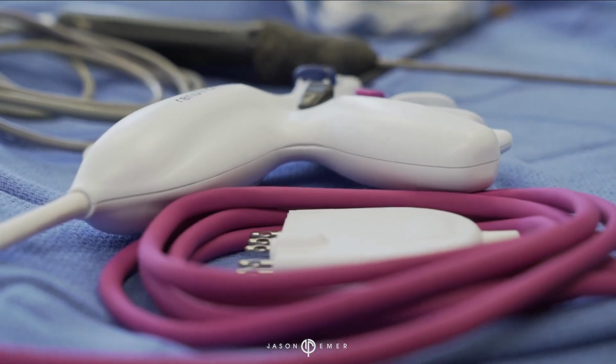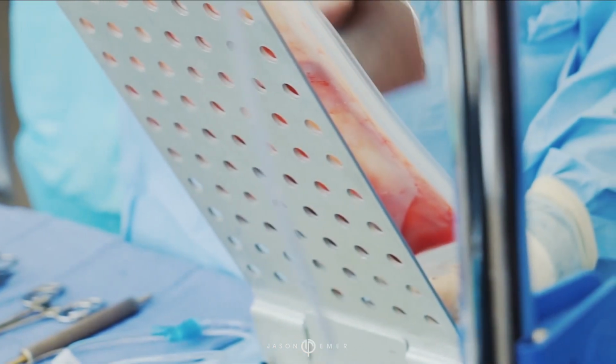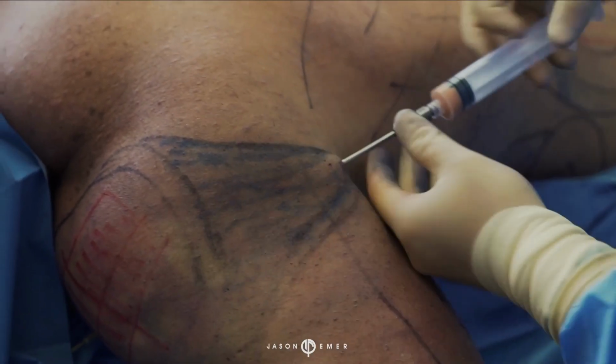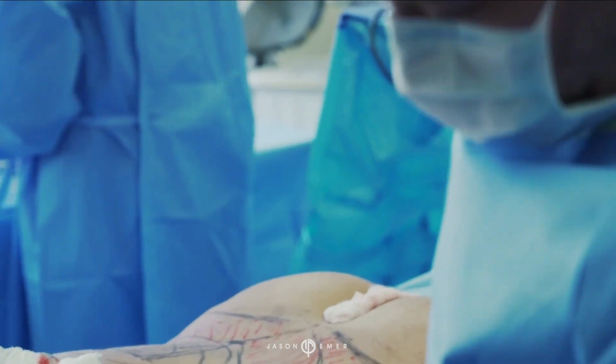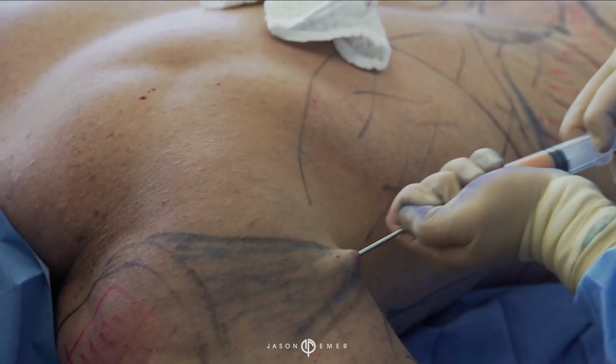We're doing the internal heating in the flanks. Most guys, this is a big problem area. So now we're going to put fat in the shoulder. You see this was taken from his back. Again, he didn't have too much, but there's enough now that we can get a nice little bulk. Give him a little bit more of that roundedness. He's super muscular, so this is really going to give a nice look to him.